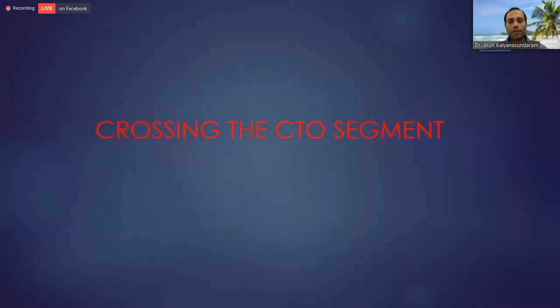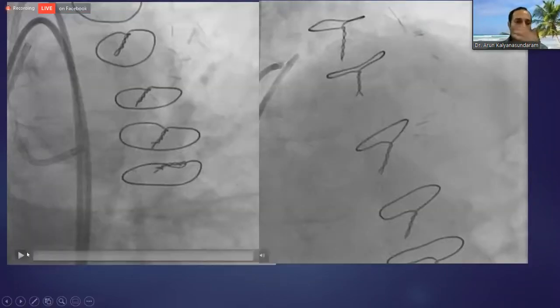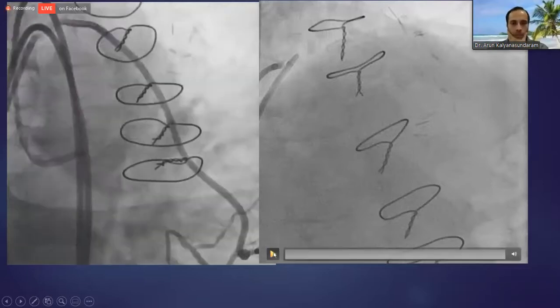So, crossing the CTO segment. This is a problem that we sometimes have, right? The wire ends up subintimal. You have crossed it, but the wire is subintimal. So what do you do? This is a case I did in India maybe a year or two ago.